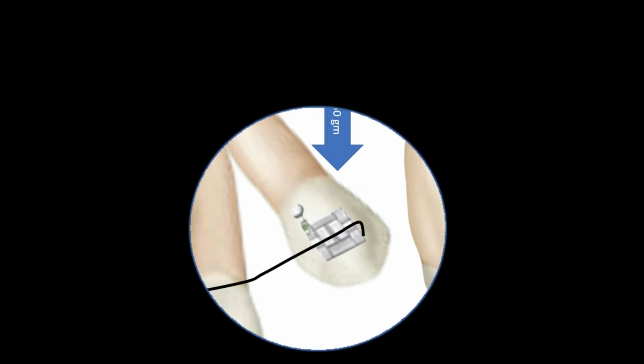Not only that, because of the rectangular wire in the rectangular slot, the canine may move palatally or buccally again depending on the orientation of the wire into the bracket slot. This is third order or torque expression of the bracket. And that is the reason two-couple system is not predictable or determinant. It is an indeterminate system. That means it's very difficult, near to impossible to calculate the force system which we were able to do in one-couple system. Let me now elaborate two-couple system with the example that you will find in your textbook.